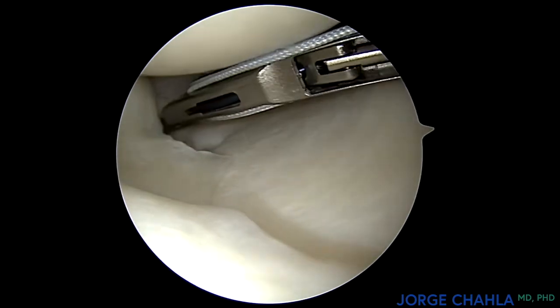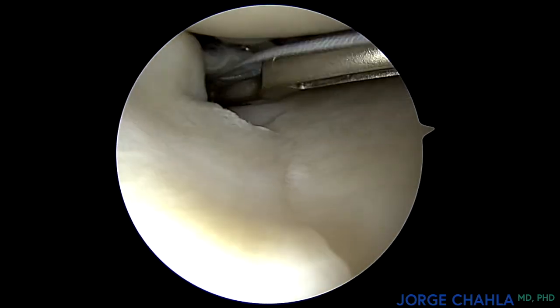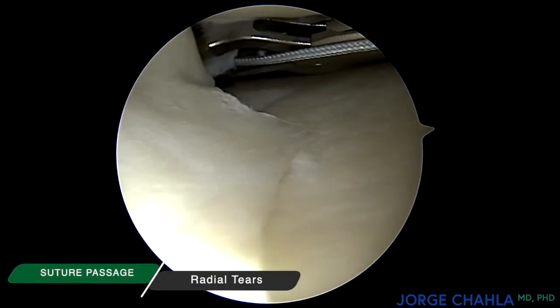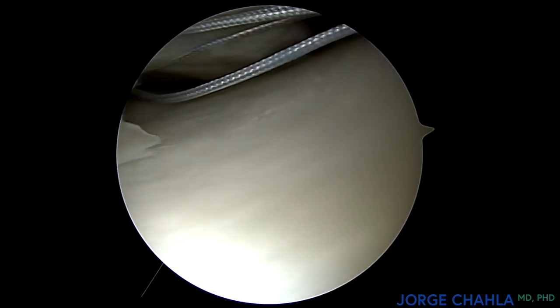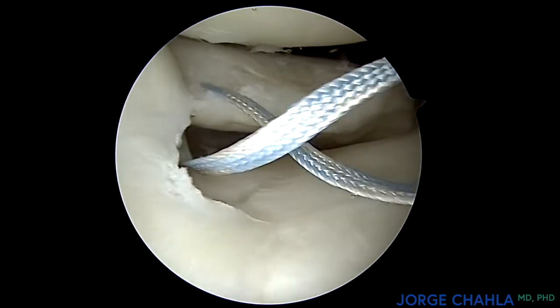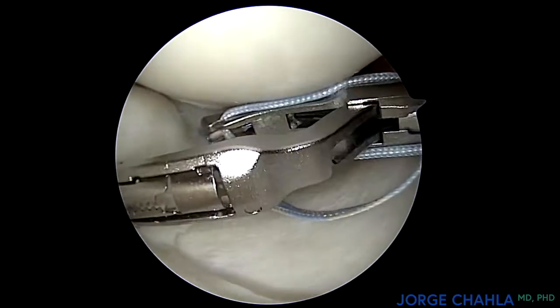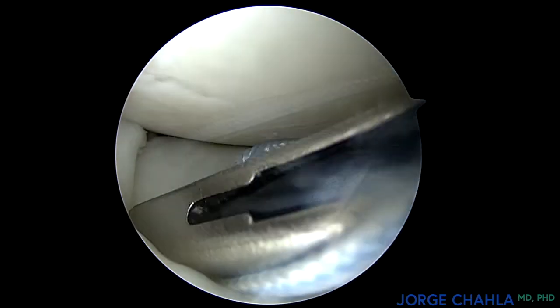A suture passer is utilized to place a vertically oriented suture through the horizontal component of the posterior aspect of the meniscus. The other side of this suture is then placed through the anterior component of the radial tear in a horizontal mattress configuration.